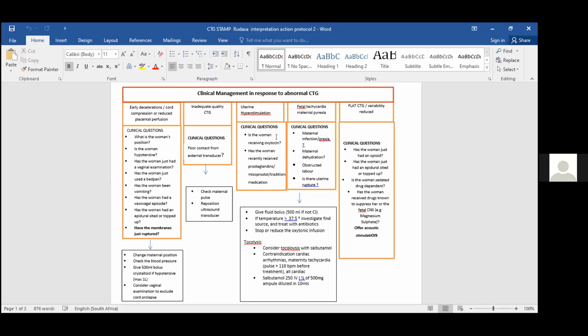Okay. And what I want to suggest to the colleagues on the group is that Prof. Hofmeyer has done a workbook. I think the most important thing to share is that workbook. Yes, we'll do that. Even if it does not classify the CTGs for you, you learn by the time you've gone through it. It's not many slides, about 20 CTG tracings. You do the trace, you interpret, and then on the next page it has the answers and shows you the abnormalities. I think doing that workbook sooner rather than later will be very helpful, so let's share that as part of the tools. Thank you very much. Yes, I'll make sure we do that.